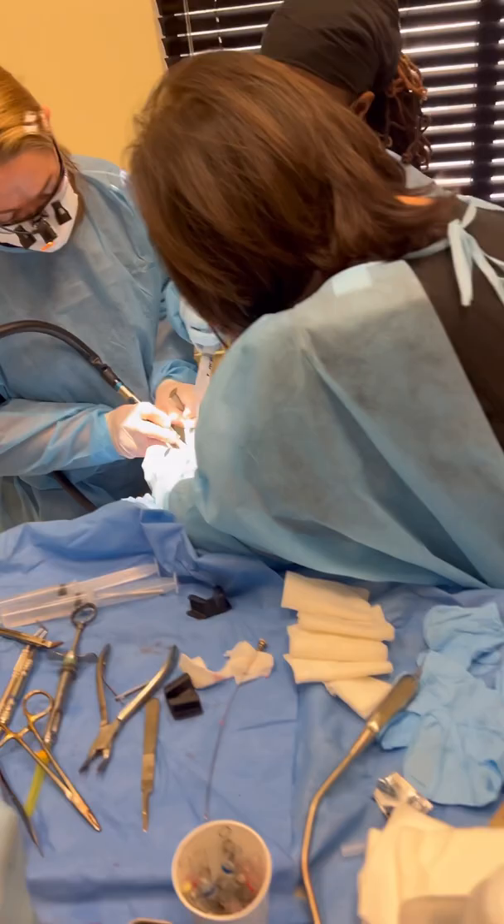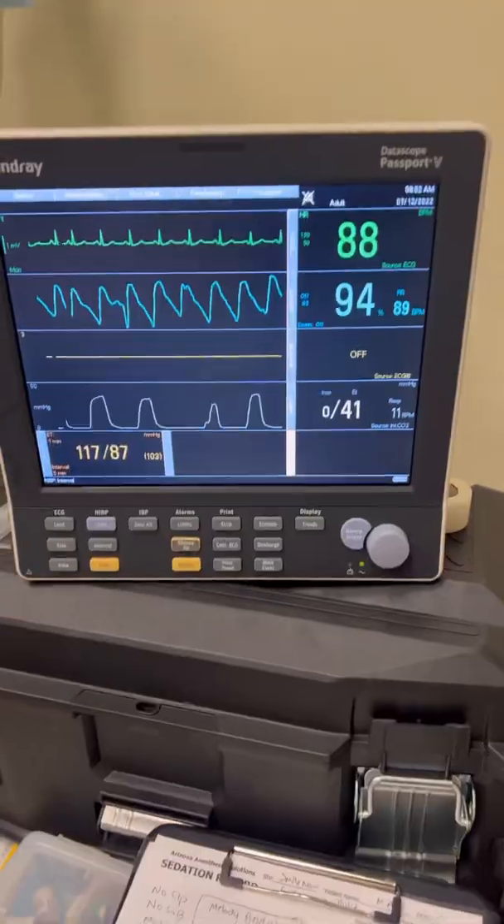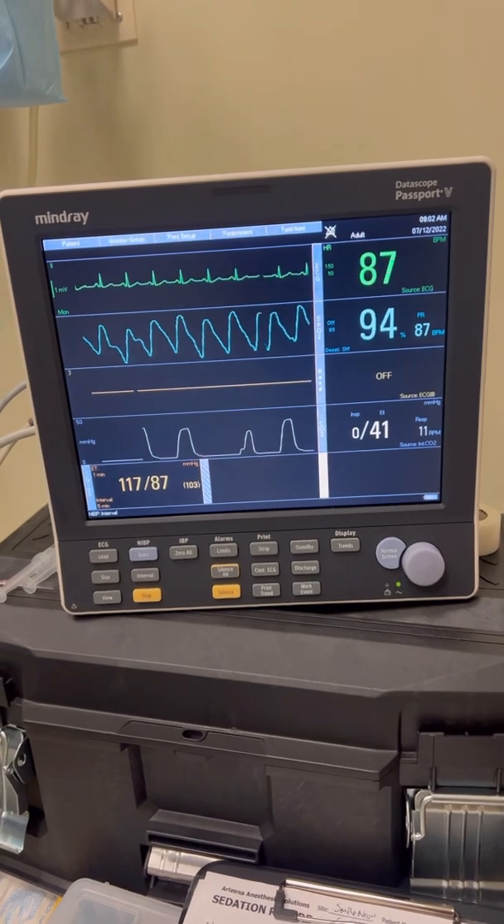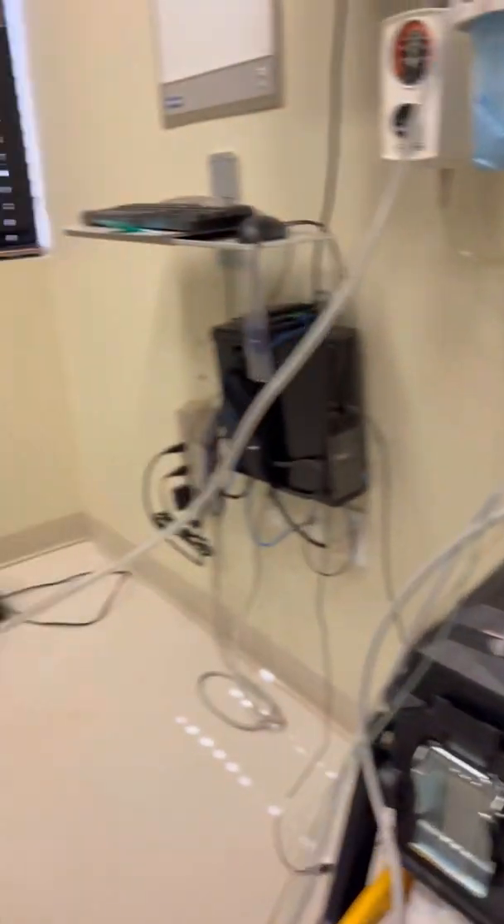We're doing some bone reduction there, using a lot of water, making sure the patient doesn't gag. Look at that — got the heart rate down to 87. Blood pressure looking really nice there.